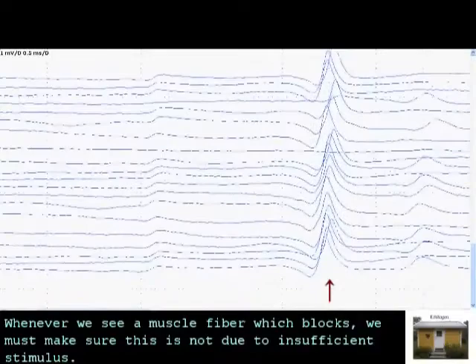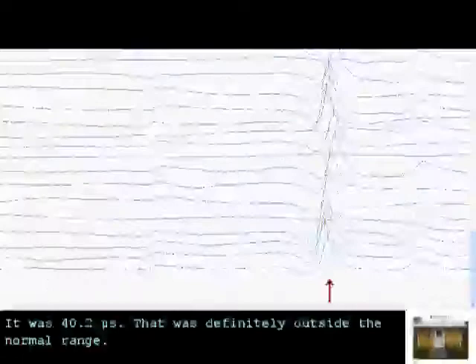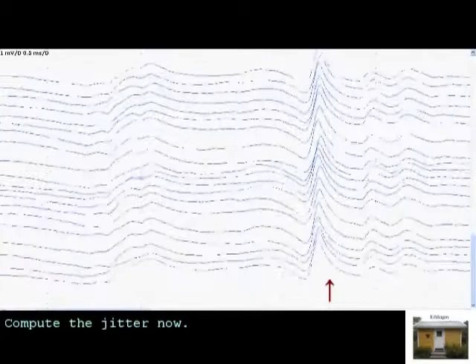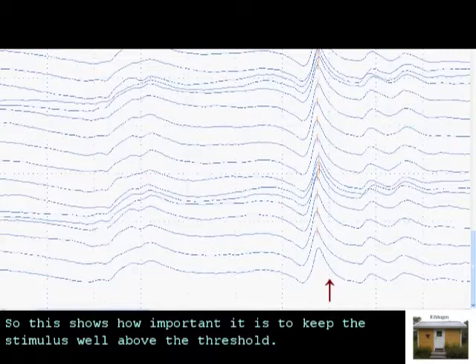So what was the jitter here that we could measure? It was 40.2 microseconds — that was definitely outside the normal range. And now we shall try to stimulate again with a suprathreshold stimulus strength. The jitter is just 13 microseconds. So this is completely normal jitter — this is the middle of the normal range.